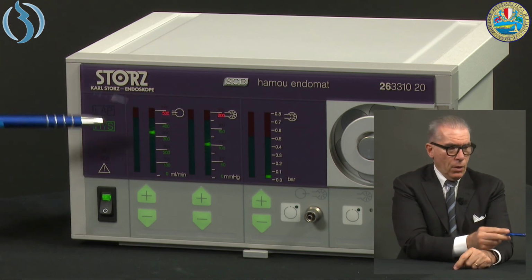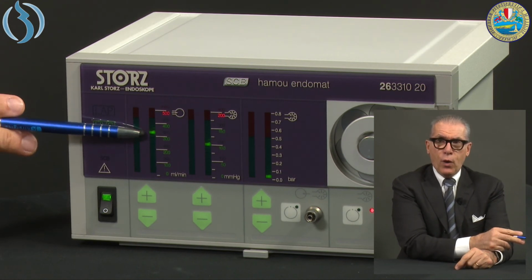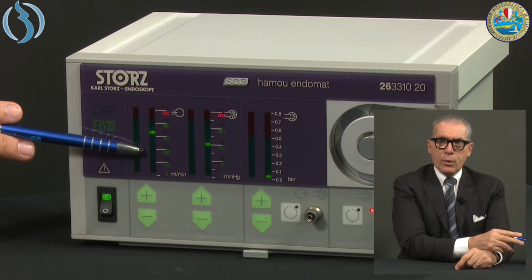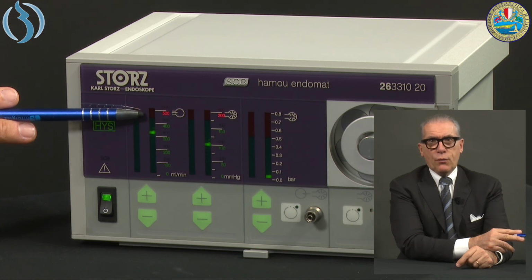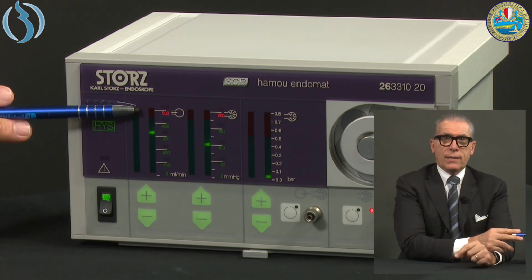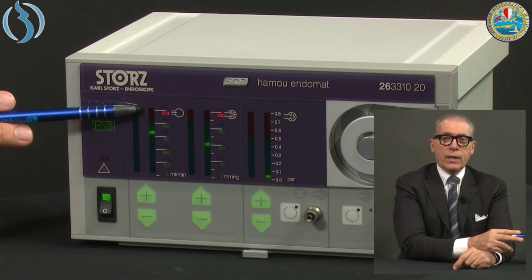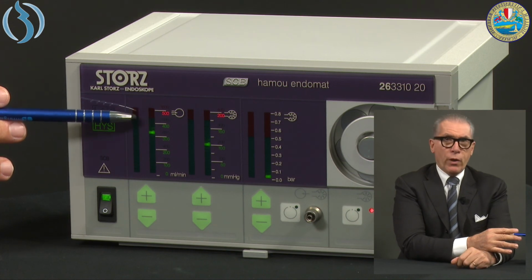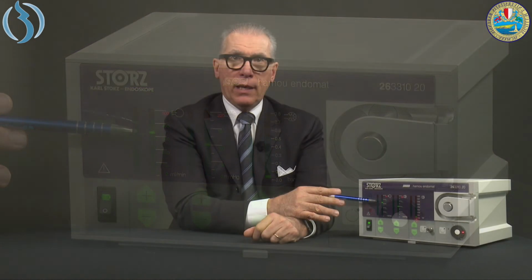Another remark: don't think that by increasing the flow, you will increase the performance. The flow increases the performance up to a certain point, but if you increase it too much, you will get the opposite effect of reduced flow inside the uterine cavity. It's called turbulence. Turbulence is the same thing airplanes encounter, and it's a kind of brake in moving the liquid forward. So please take note of these parameters. They are mandatory in office hysteroscopy to get 45-50 millimeters of mercury.